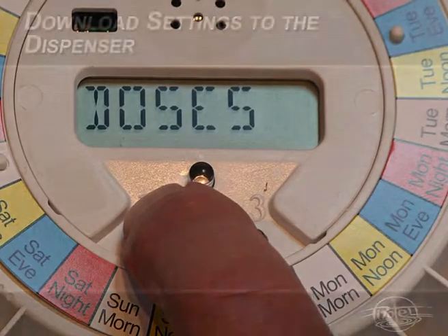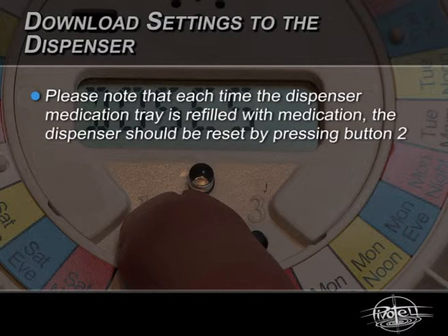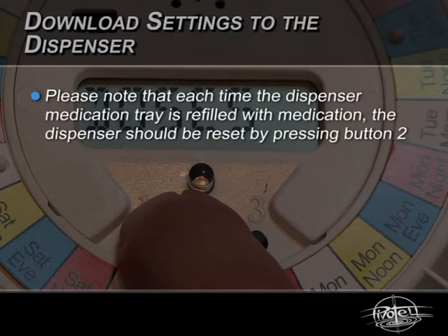Please note that each time the dispenser medication tray is refilled with medication, the dispenser should be reset by pressing button 2. This will update all of the settings, reset the number of doses left in the dispenser, and upload the actual dispensing times of the previous medication cycle to the Administration Centre.